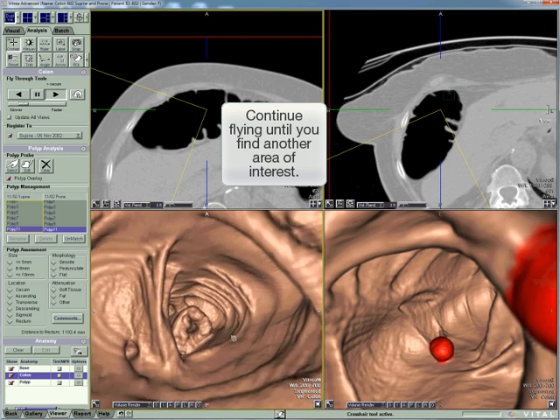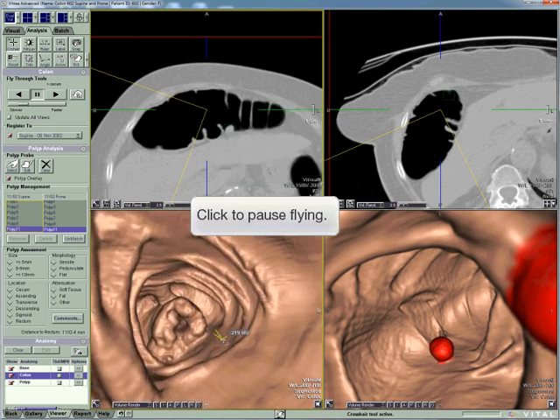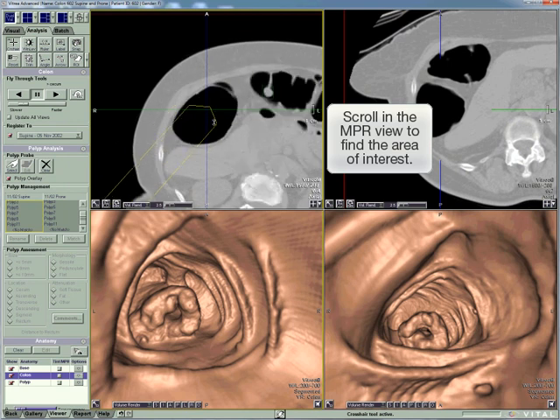Continue flying until you find another area of interest. Click in the view or click the pause button to stop flying. Scroll in the NPR view until you find the area.